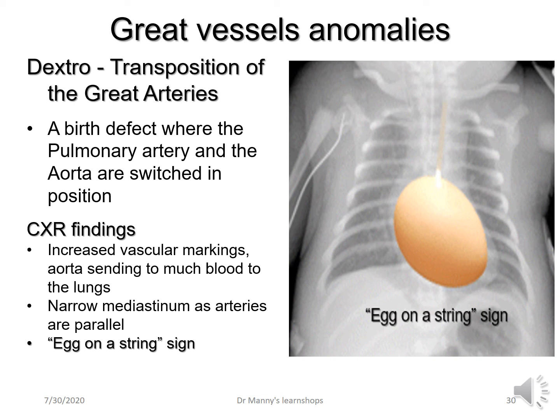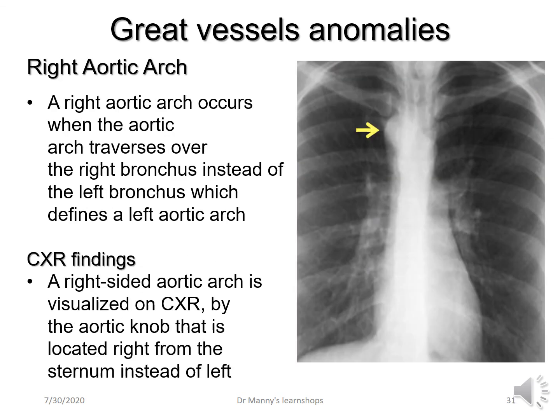The egg on a string sign. The infant won't be very well. Then you've got certain anomalies, which I've just chosen for interest. The great vessel anomalies, a right aortic arch.